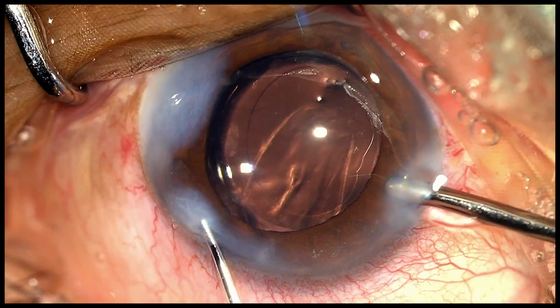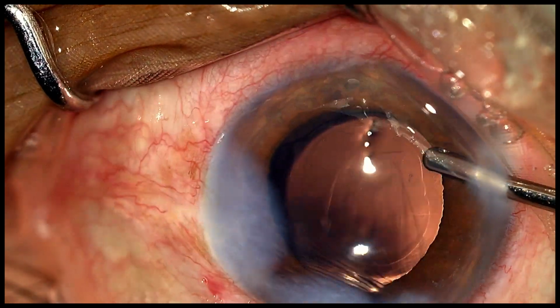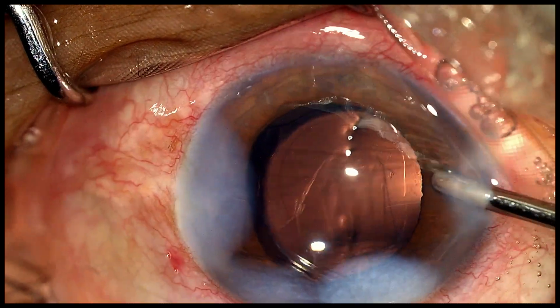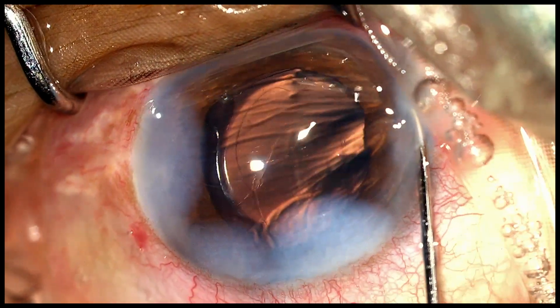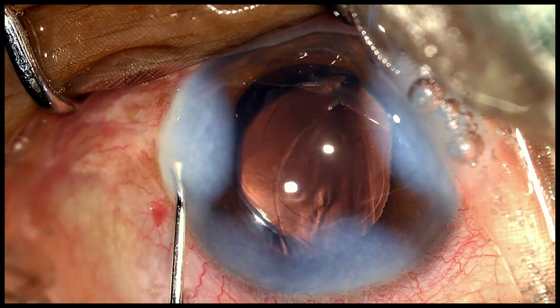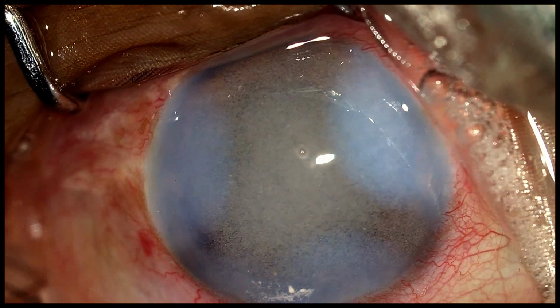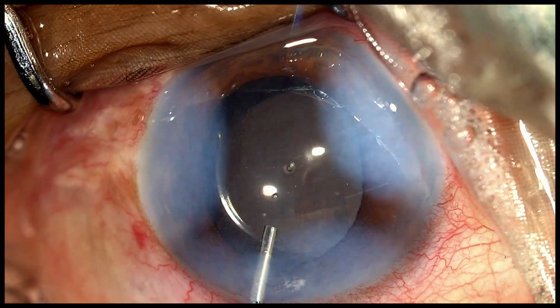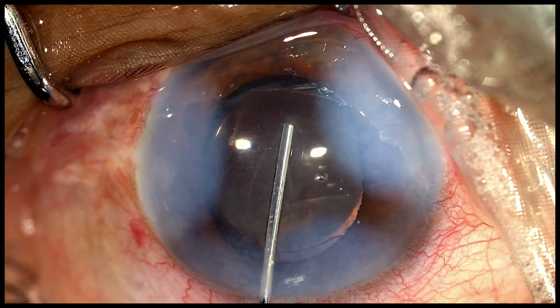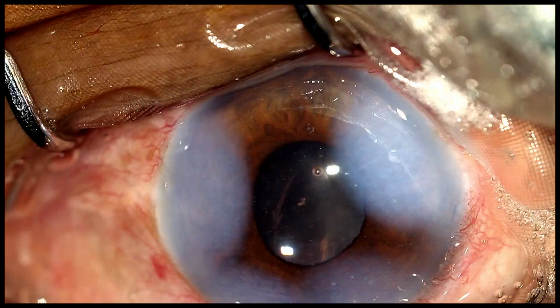Following the completion of the visco wash, the aspiration cannula is removed from the eye, the paracentesis in the main incision is hydrated, and finally the right paracentesis incision is also hydrated. A last quick check by injecting some triamcinolone in the anterior chamber, and we can clearly see that the anterior chamber is completely free of vitreous. And this then finally is the end result that we achieved.